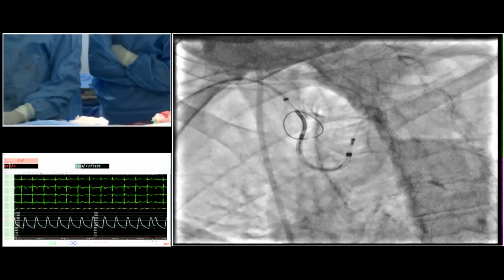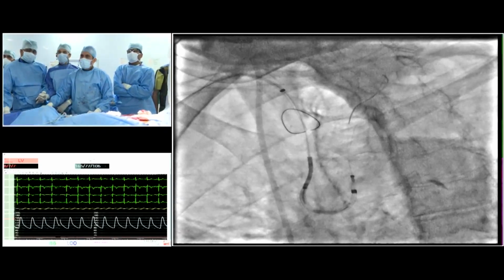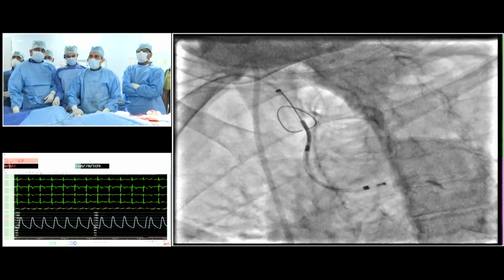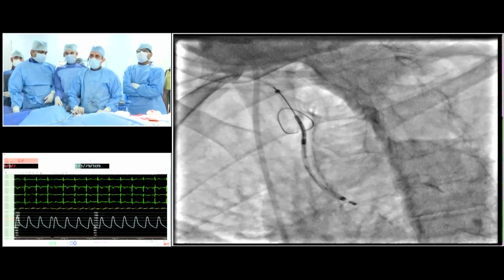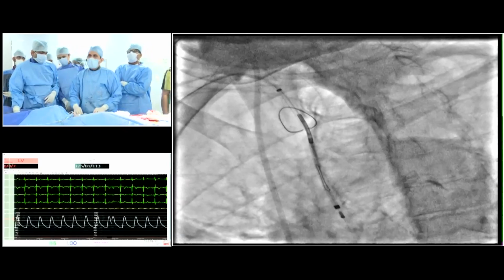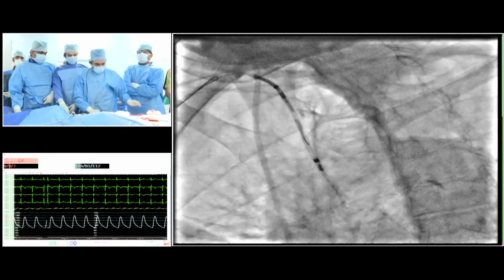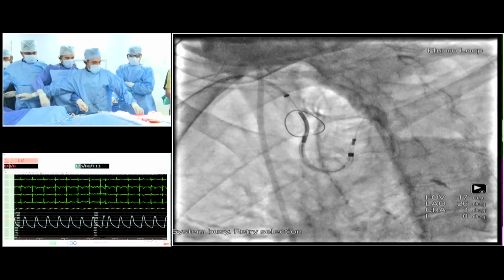So that's a very important statement coming from a great expert. And all the data on bicuspid valve is coming from Raj Makar. And in this country, you can have up to 30% of bicuspid valve. I saw a case of single leaflet at the age of 42. I was really nervous about the case. Result was impeccable. Single leaflet at the age of 42, safe, with a huge aorta.